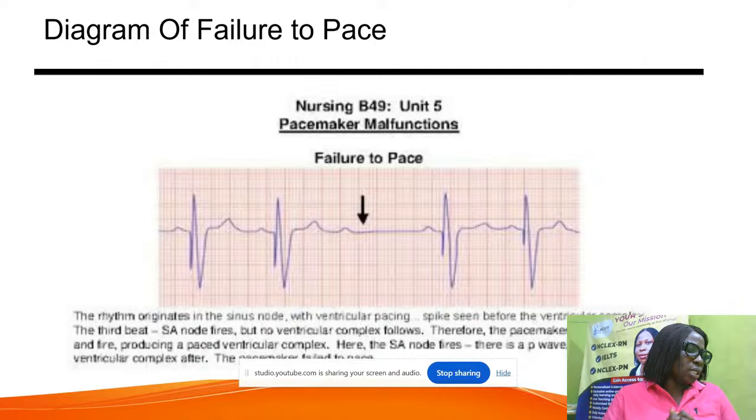So, any question on these abnormalities? Failure to pace, failure to sense, failure to capture. Any question on the other ones we've mentioned? The last thing we're going to do tomorrow is the 3 AV blocks or the 4 AV blocks.